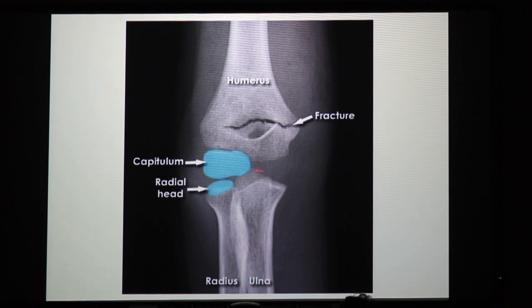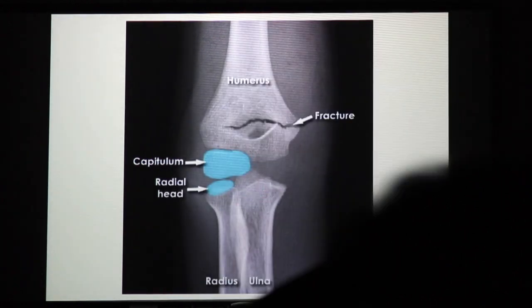But this is the capitulum. Trochlea is not even visible here. The notch is not visible here. The head, look at it. How is the radial head? Does it look like this? So again it's a minor. You said right. But why did I overlap? So you can be deceived by looking at these types of images. So develop your thought process to understand all that.